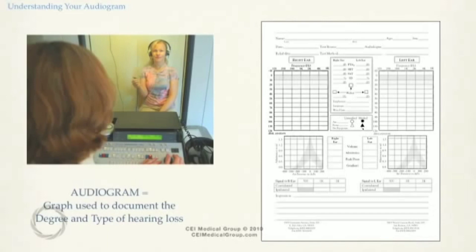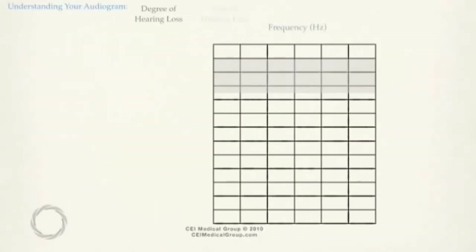Frequency is depicted along the x-axis, increasing from low to high frequencies from left to right. This is similar to how the keys of a piano go from low pitch to high pitch.